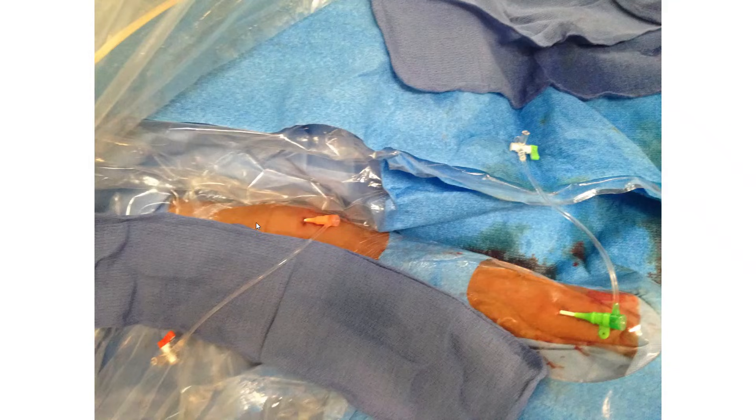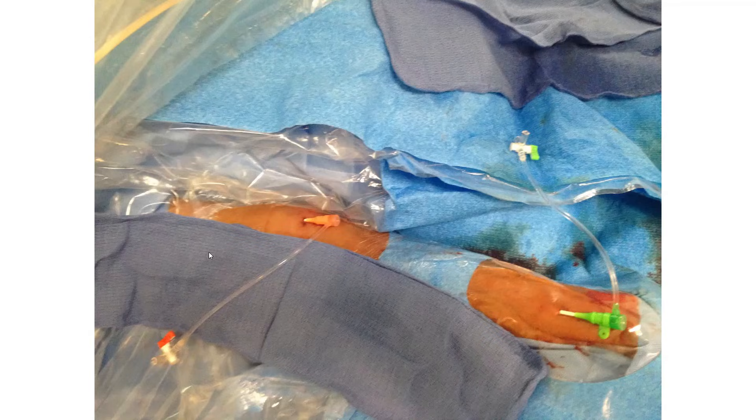You can stick in this position with the arm juxtaposed to the body. But since we stick very medially the basilic vein, sometimes it's hard to stick it in this position. So you may start with the arm abducted away from the body, stick under ultrasound with the elbow covered by some sterile towels.